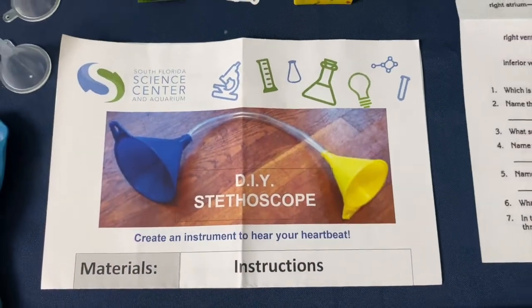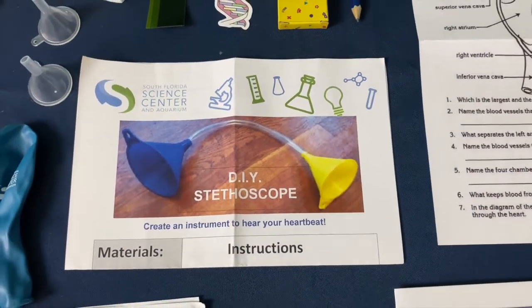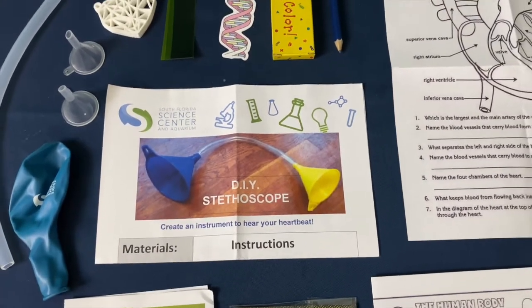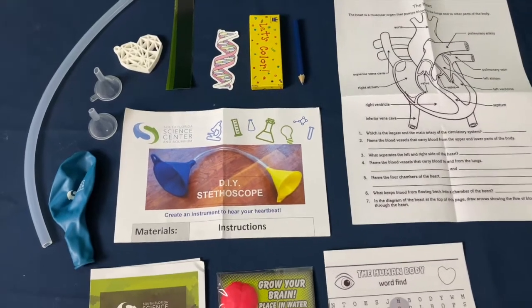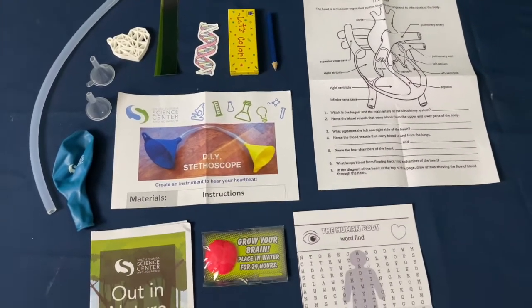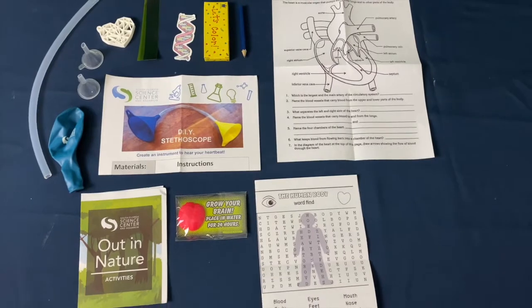In this STEM kit, we're going to be making our own DIY stethoscope. You've probably seen a stethoscope before, hanging around a doctor's neck next time you go to the hospital. But we're going to be making our own stethoscope so that you can observe your heart — not to look at it, but to listen to it. Make sure you have a nice, healthy heartbeat. So let's jump into it.